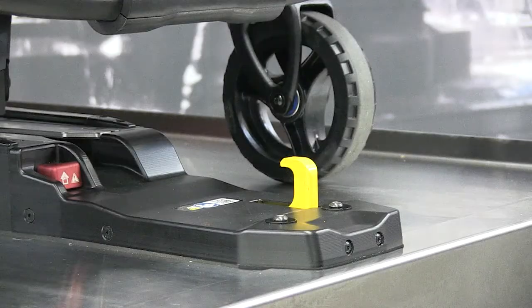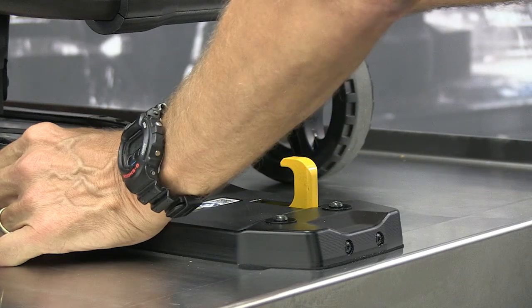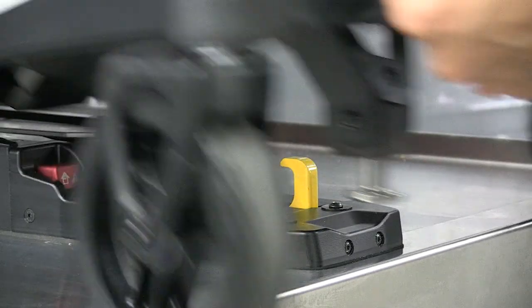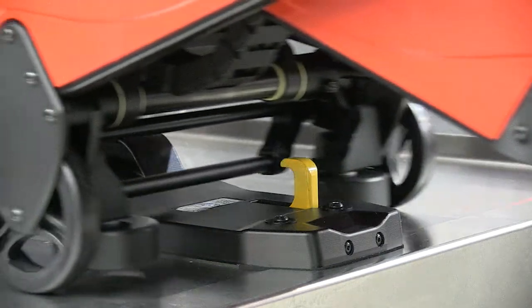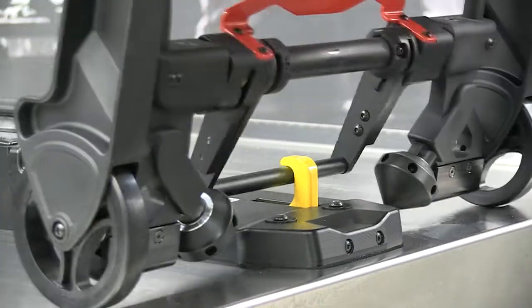The inline fastener features a release button which is located on the nose of the system. Press the button to unlock the compatible FERNO product for unloading. Begin pulling the cot toward the back of the vehicle, then release the button as you continue to pull the cot from the vehicle. The safety hook is located on the nose of the fastening system.